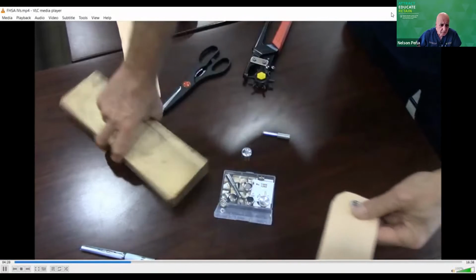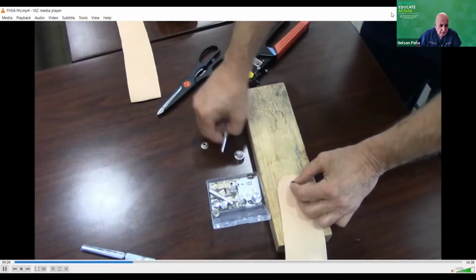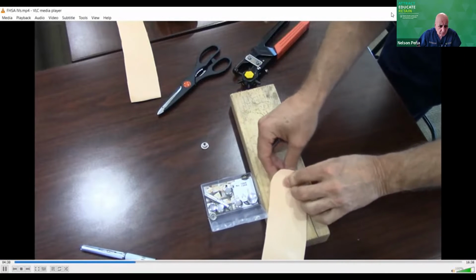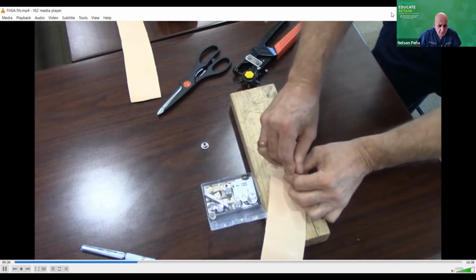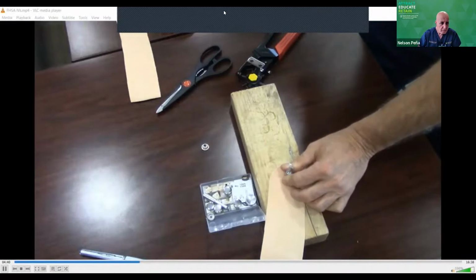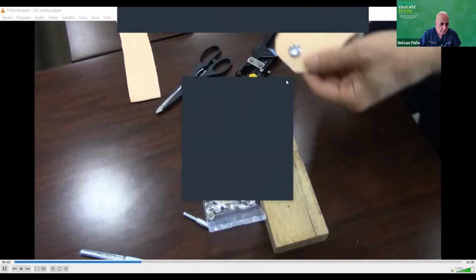And now I need to finish it off by using the little punch. So I'm going to put the bottom that's round for the snap on underneath, and I'm going to use the punch on top. And with a hammer, I'm just going to tap it in there. And voila, I now have the snap permanently in this strap.